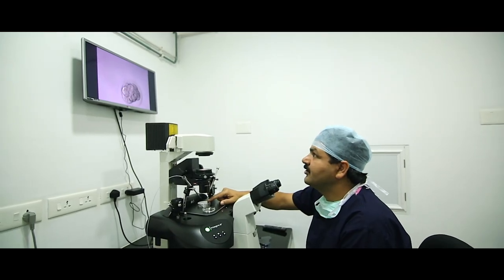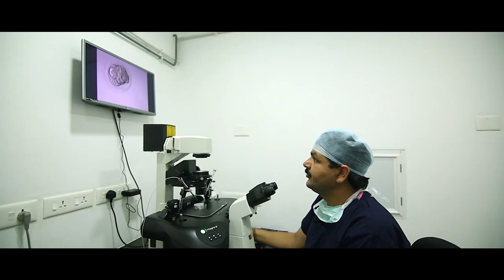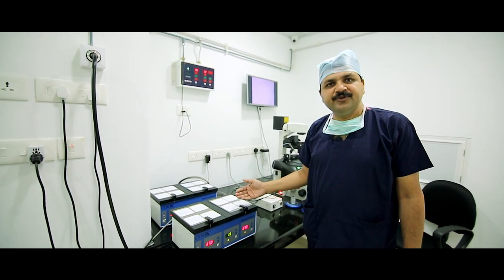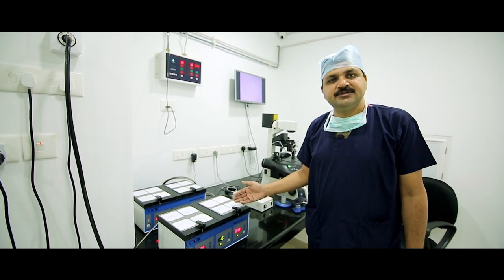This is a Day 3 compact embryo — a good embryo compacting at Day 3 stage. This is an 8-cell embryo. The rest of the stages follow as per IVF: Day 2 observation is 2 to 4 cell; Day 3 is 6 to 8 cell embryo; Day 5 is blastocyst.